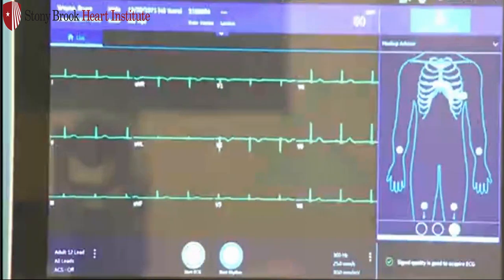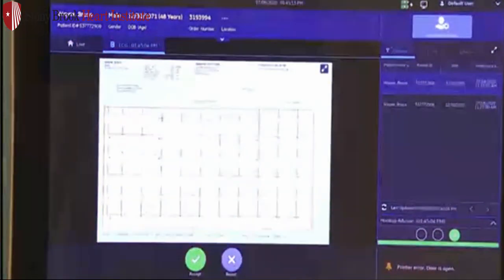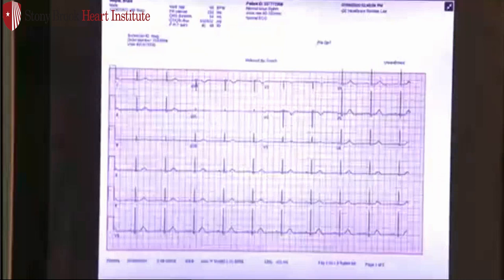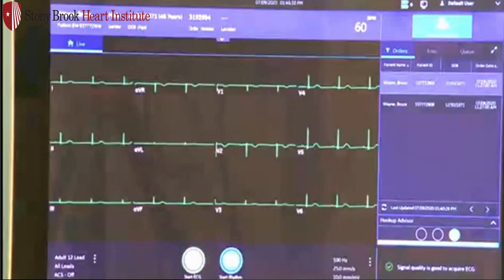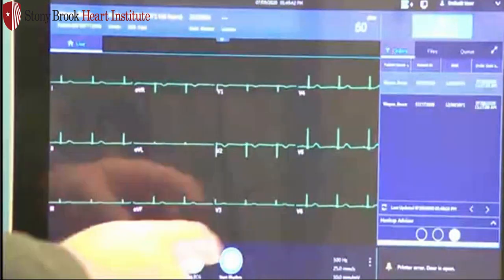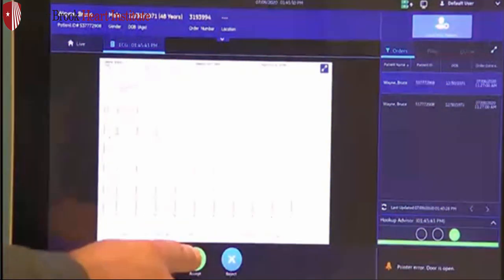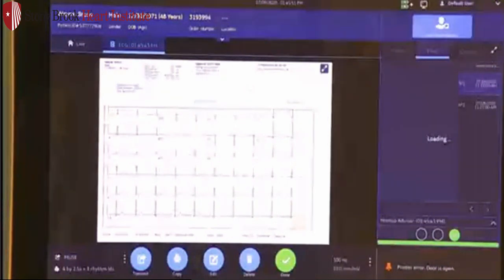In this scenario, I have a simulator already on the patient. Look at your hookup advisor — ensure you have green quality. When you're ready to acquire the ECG, you can use the touch screen, the keyboard, or the acquisition module. If I press Start ECG, it's going to capture that ECG. However, I'm not quite done yet — think of this as a preview screen. From here, I can make sure it's a good quality again. I can expand the ECG with the double arrows to get a full page view, confirming good quality and correct patient demographics. If I'm not satisfied, I can hit reject — it maintains all my patient information but brings me back to the live screen so I can adjust electrodes or do a better prep job. Once ready, hit Start ECG again, and if satisfied with the preview, hit accept.